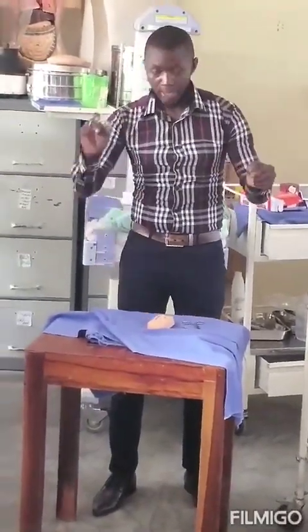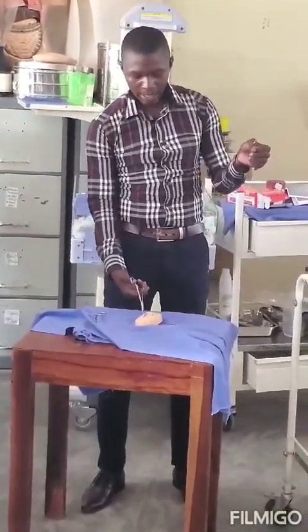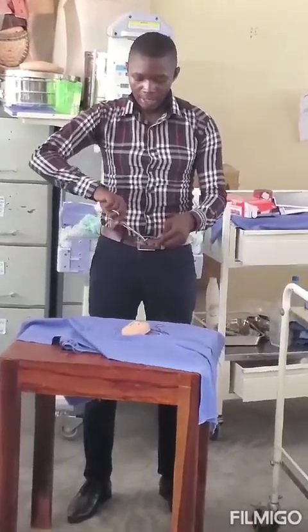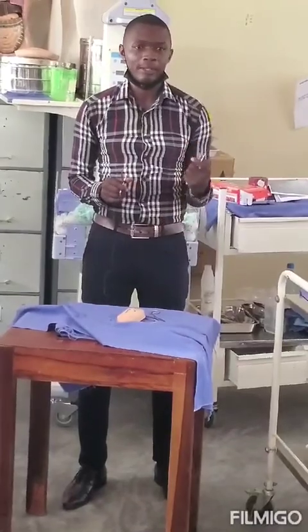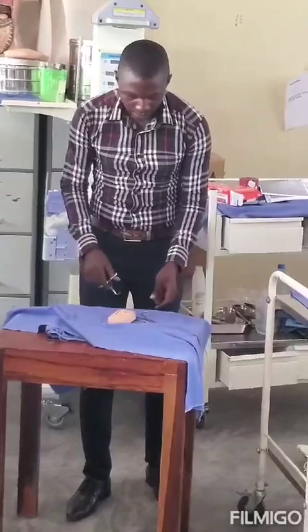So you are going to put this forceps down, get the scissors, and cut this one here. After cutting, again you get the same forceps and position your needle nicely, and go back on the wound and make another knot. But you'll find that mostly during your exam, immediately you make one knot, the examiner will say, give IEC, because by the time you're reaching here, you're only remaining with seconds. So immediately they say, give IEC, just cut and remove everything.